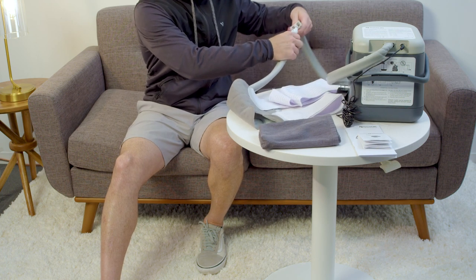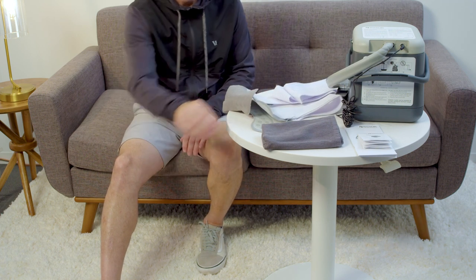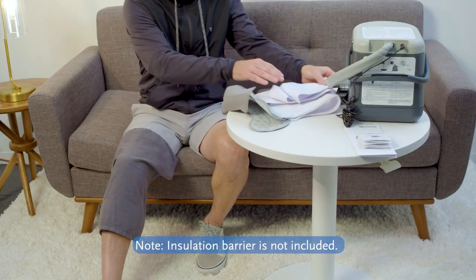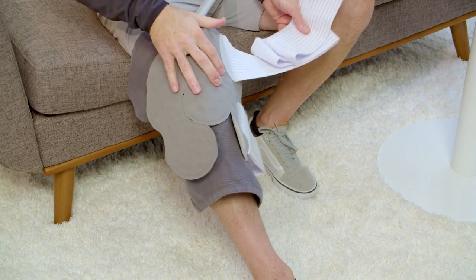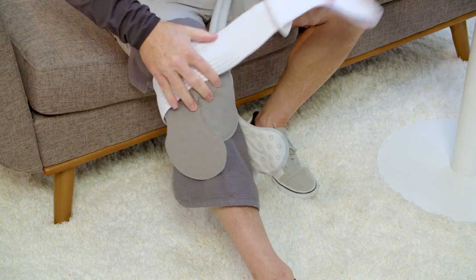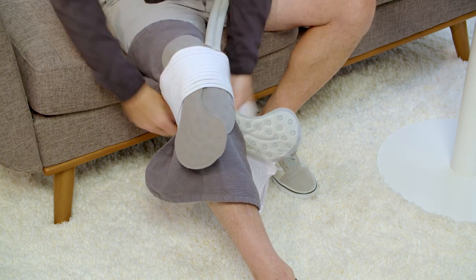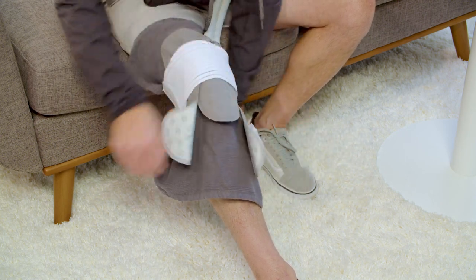Connect the Cold Rush pad to the hose extending from the device. To ensure proper connection, push the couplings together until they snap into place. Apply an insulation barrier over your skin in the area to be treated. Apply the Cold Rush pad over the insulation barrier. The Cold Rush pad should never be applied directly over your skin.